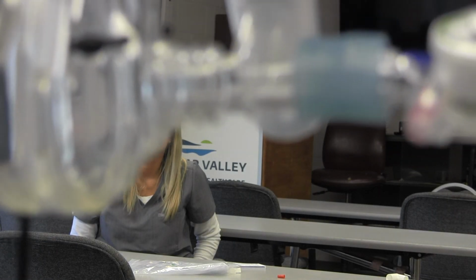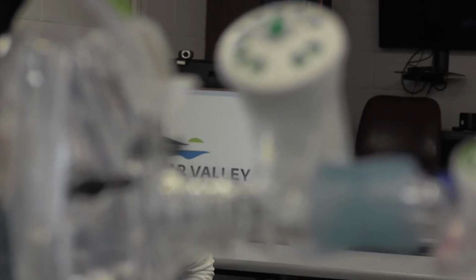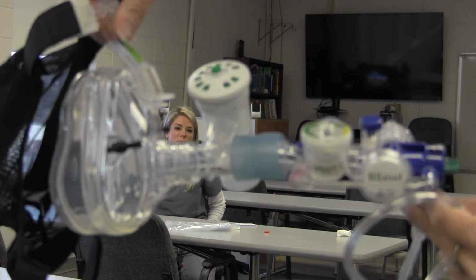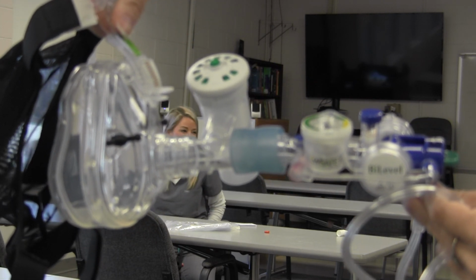Back up with it just a little bit for me. What number are you starting at? It depends on what we're using it for. Okay. As far as, you know, the asthma, COPD, CHF, or drowning, near drowning. I would say just adhere to your policy on that one, because I can't speak on it.